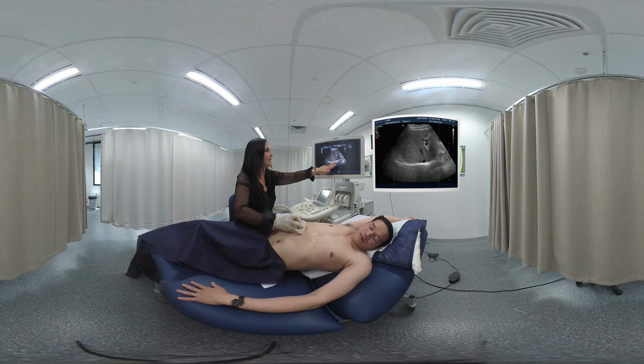Big breath in for me. Let's set our focus up there. Can you see that? We're just getting a heap of shadowing, so we're not seeing the gallbladder. There's our main lobar fissure, there's our common duct, our portal vein, and we're getting all of this shadowing from all of these stones that are seen here. So there's the bowel. We can see the bowel peristalsis.